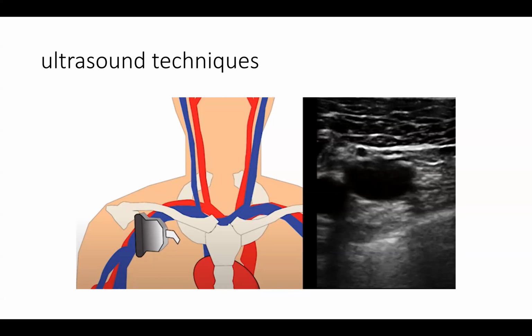The ultrasound helps and guides you that you should not go beyond that pleural space, because if you go beyond that pleural space, you are likely going to cause hemothorax. And as you scan the ultrasound through, you will see how the vein moves and how you now turn the marker towards the head to slant it into a longitudinal view.